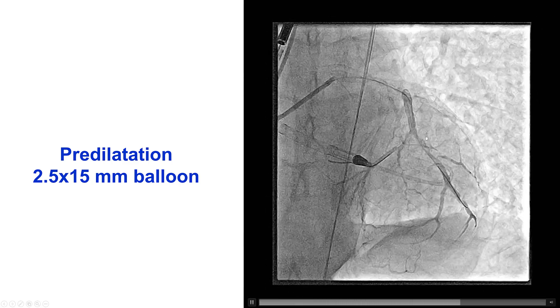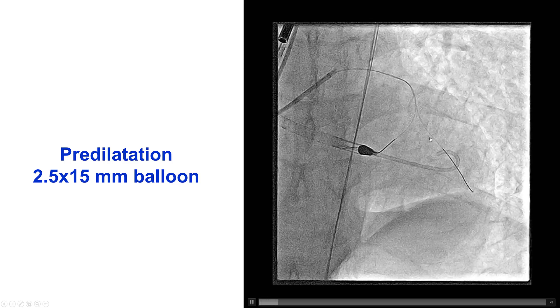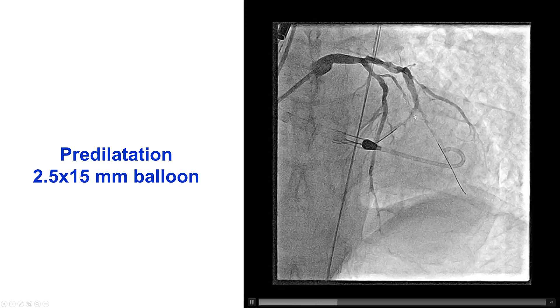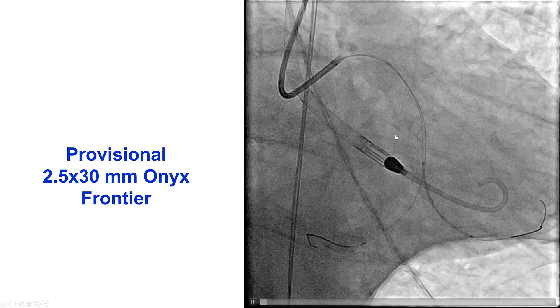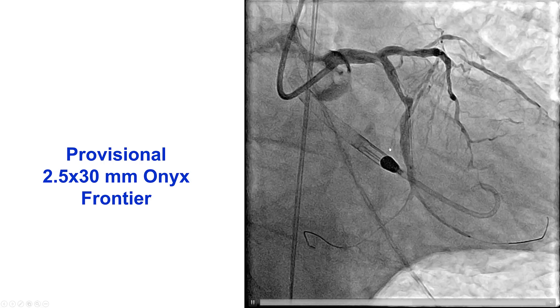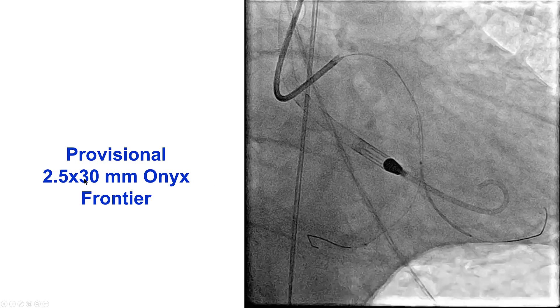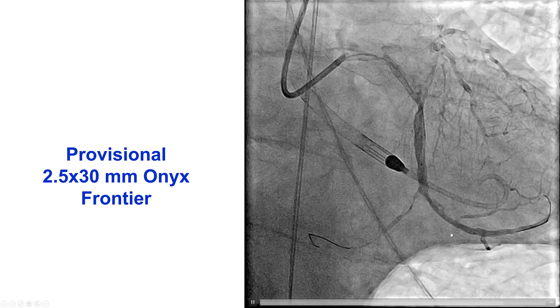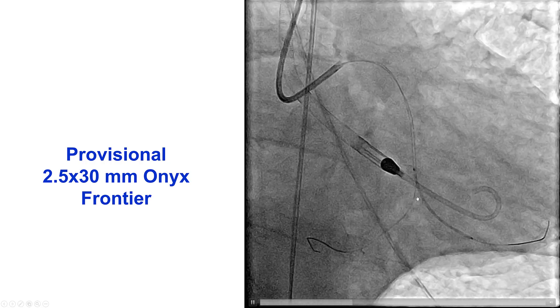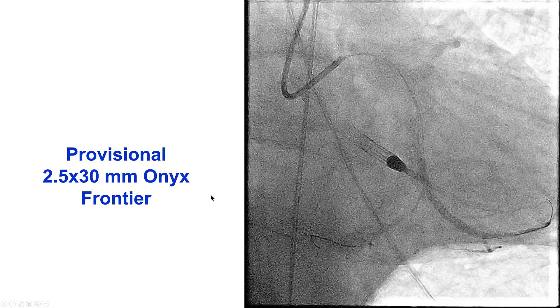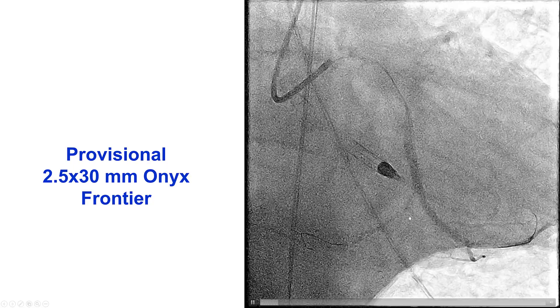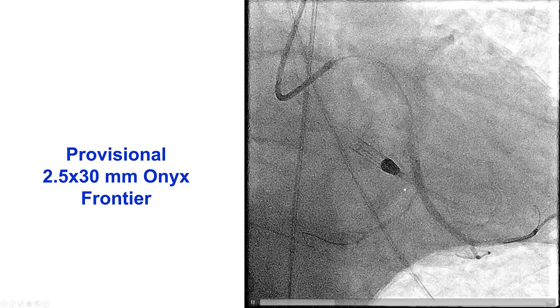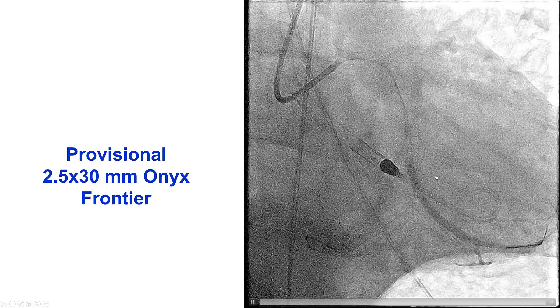This is from the cranial view, showing thrombus in the proximal segment of the second obtuse marginal, as well as some disease in the proximal circumflex. We decided to use the provisional approach, placing a 2.5 by 30 mm Onyx Frontier stent from the second obtuse marginal to the mid-circumflex, jailing the circumflex. Given the patient's poor hemodynamics and emergency situation, we decided to proceed with an attempt for provisional stenting.